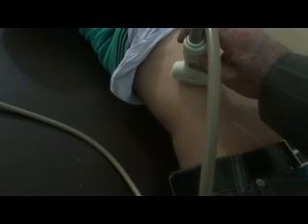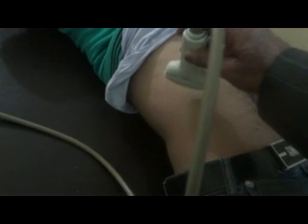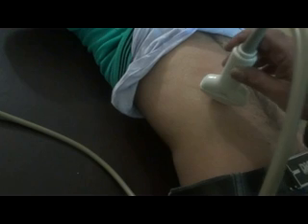With the patient supine, place the probe in the sixth or seventh intercostal space, go along the intercostal space, and if required, angle it towards the patient's left side. By doing so, you will see the gallbladder in this image. This is the portal vein, and you can see that the portal vein is at right angles to the neck of the gallbladder.